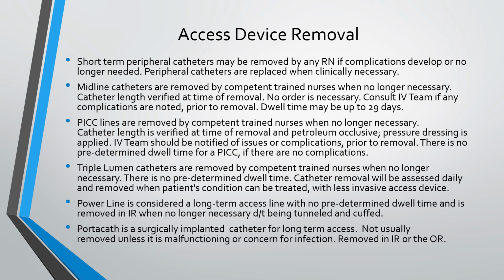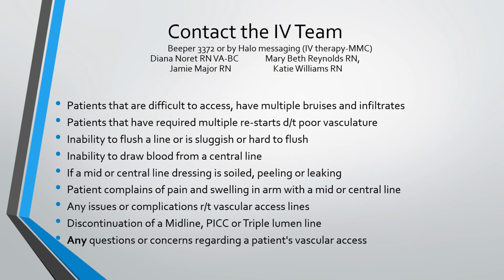A portacath is a surgically implanted catheter for long-term access, not usually removed unless it is malfunctioning or there is a concern for infection. Removed in the IR or OR only. The IV team can be reached by halo messaging IV therapy, generally between the hours of 7 A and 7 P, 7 days a week.